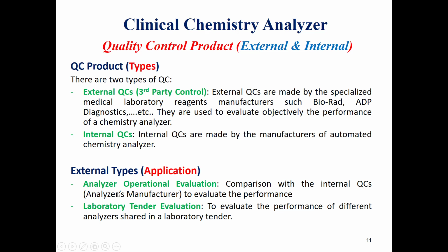The application of the external quality control products, we apply them in order to make, as we said, a comparison with the internal quality control, which are made by the manufacturer of the analyzer itself, in order to evaluate the performance objectively of this analyzer.